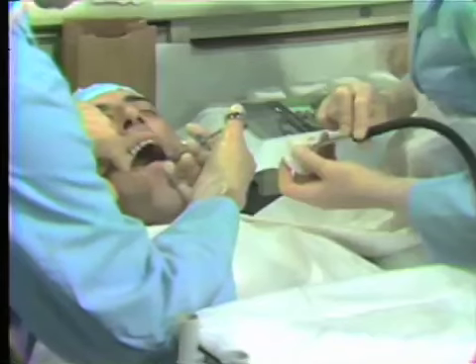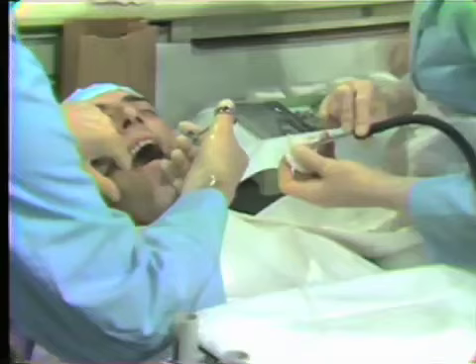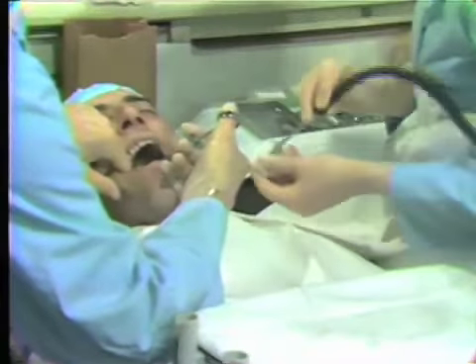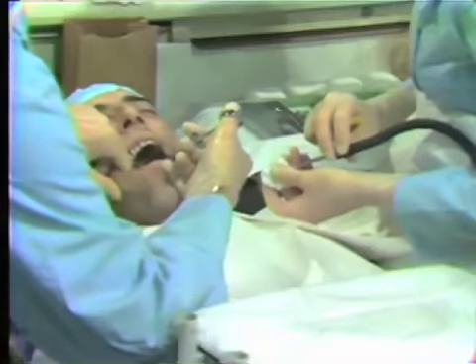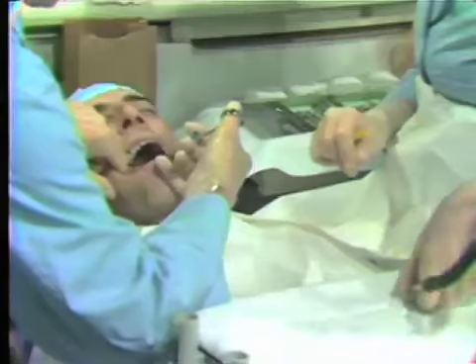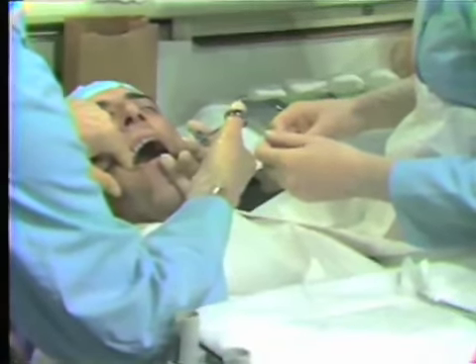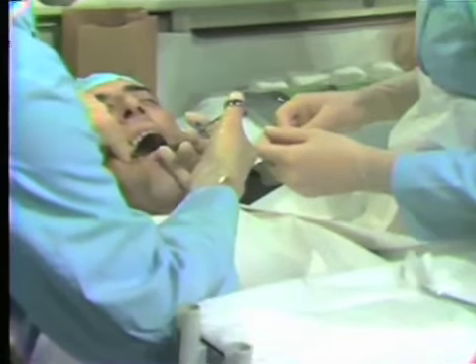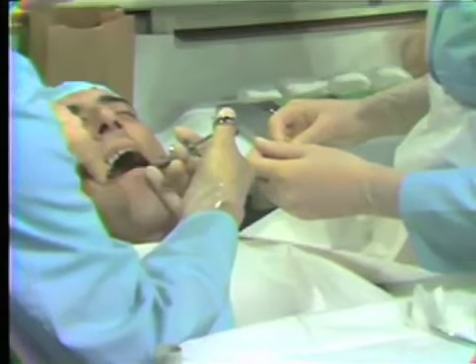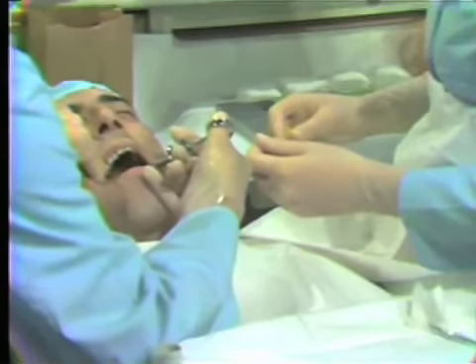The procedures we would like to demonstrate have to do with the things the assistant will be helping you with during periodontal surgery. These will be basically things related to passing of instruments, to aspiration techniques and retraction techniques during the procedure. And we'll begin with administering the local anesthetic for our patient, and we'd like you to take special note of the passage of the syringe during the injection. Passing of the syringe is a bit different from passing of the regular hand instruments, and we will demonstrate passing of the syringe as we inject our patient at this time.